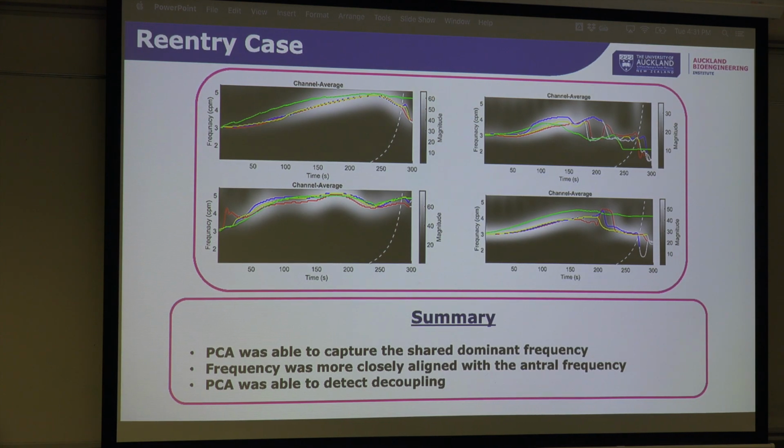I am sorry, this is a bit of a complicated diagram. We did use body surface Laplacian, but we also investigated other methods as well. And this graph shows all of them. The green line on all 4, which represents the 4 different subjects, shows the dominant frequency of the serosal activity. The blue, yellow, and red show different techniques' ability to track that serosal activity.